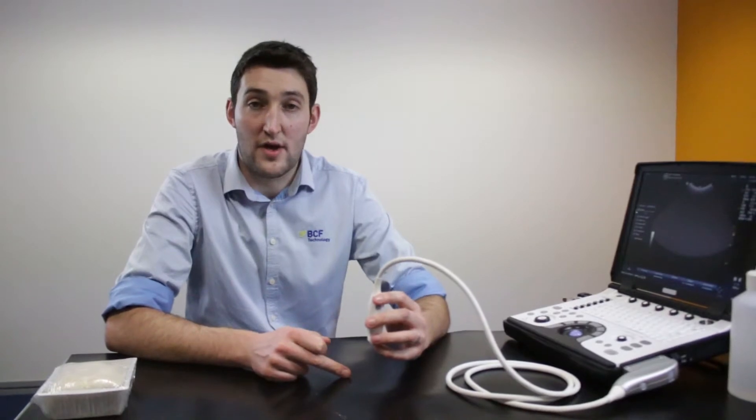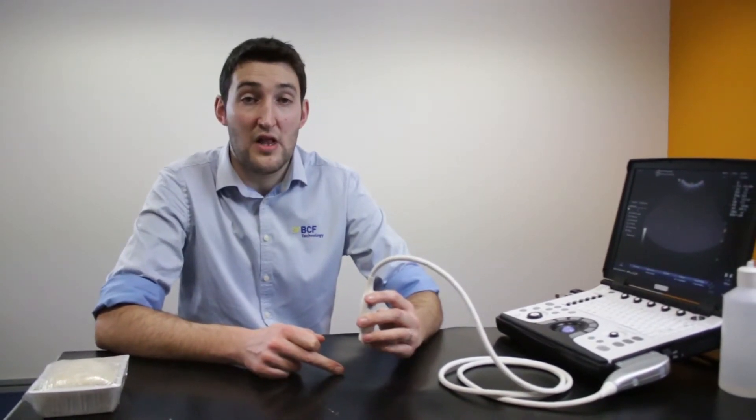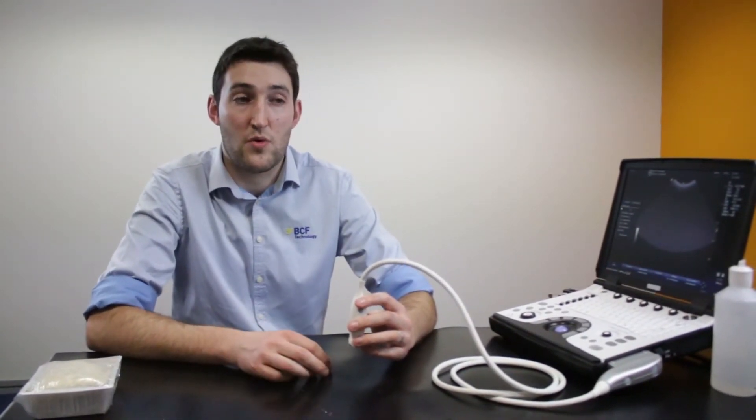And then also making sure that the focal position is at the level of whatever it is you're going to sample as well. So that when we're sticking the needle into the tissue, you're going to have the best possible image quality.